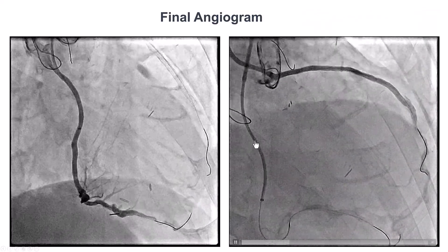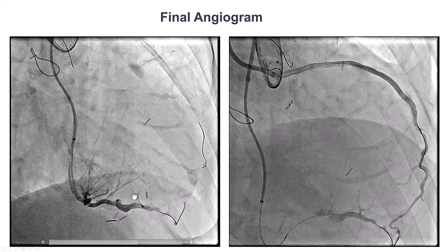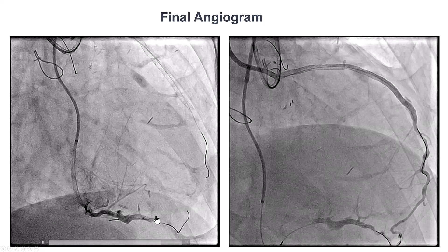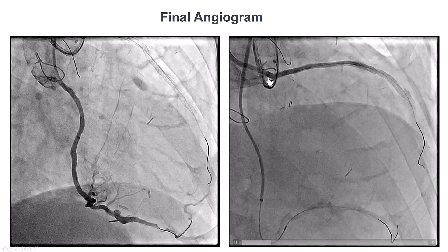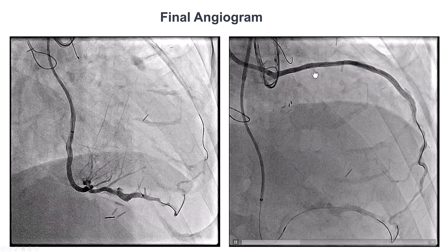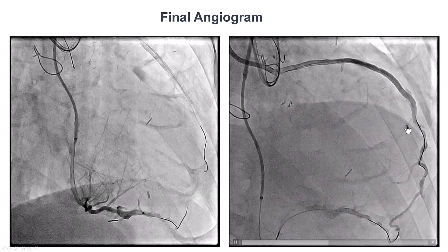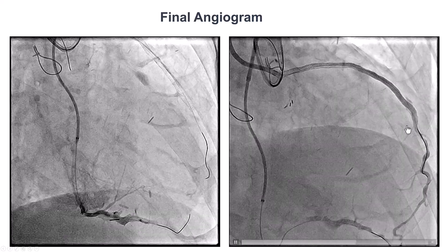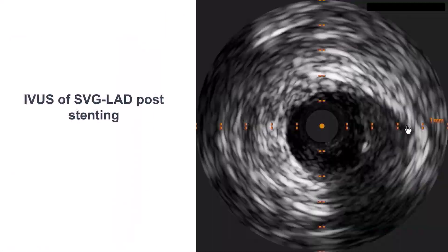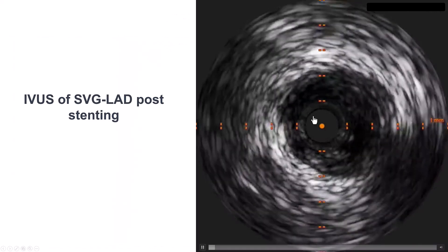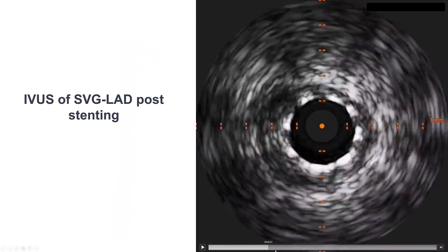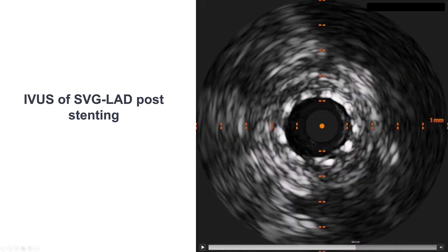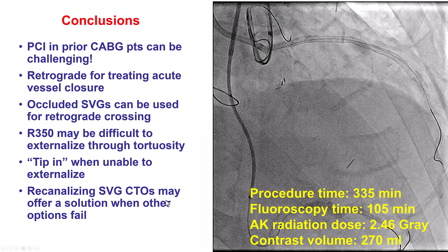This was the final angiogram. Now there is flow into the RCA, and there is also flow into the LAD coming from the previously occluded saphenous vein graft to the LAD. We did intravascular ultrasound of the saphenous vein graft — that was a good result with good stent expansion throughout the SVG.